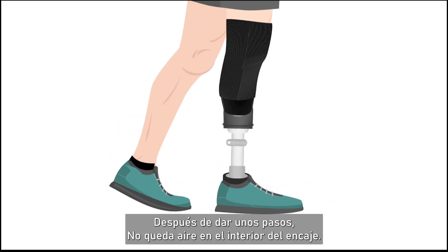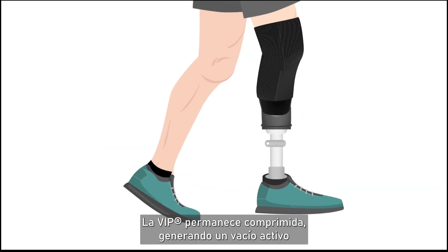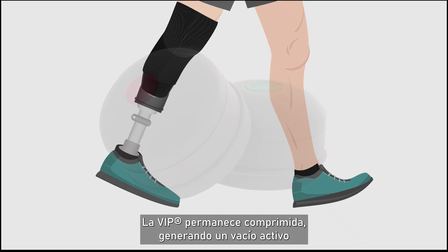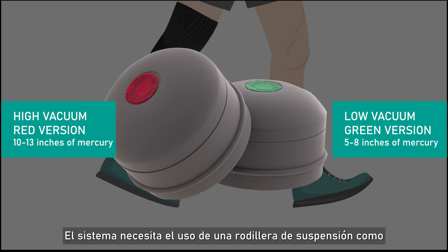After a few steps, there is no air left inside the socket. The VIP remains compressed, generating an elevated vacuum up to 13 in HG in the red version, or up to 8 in HG in the green version.